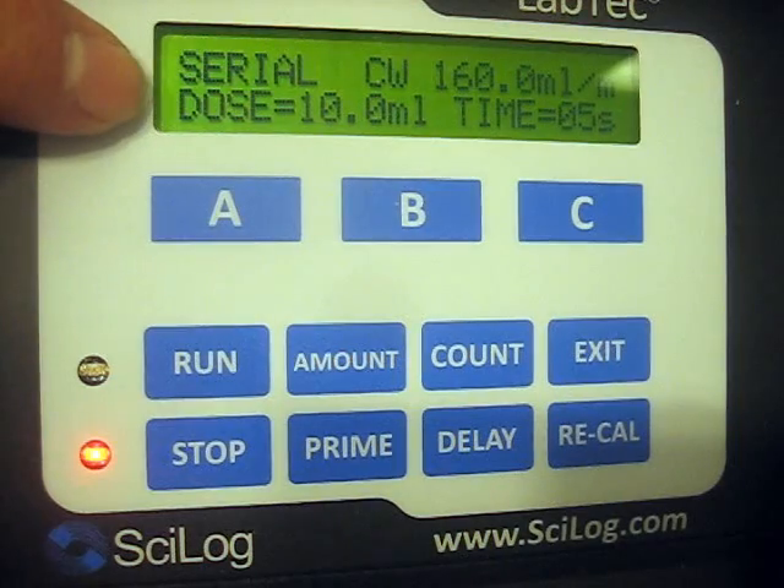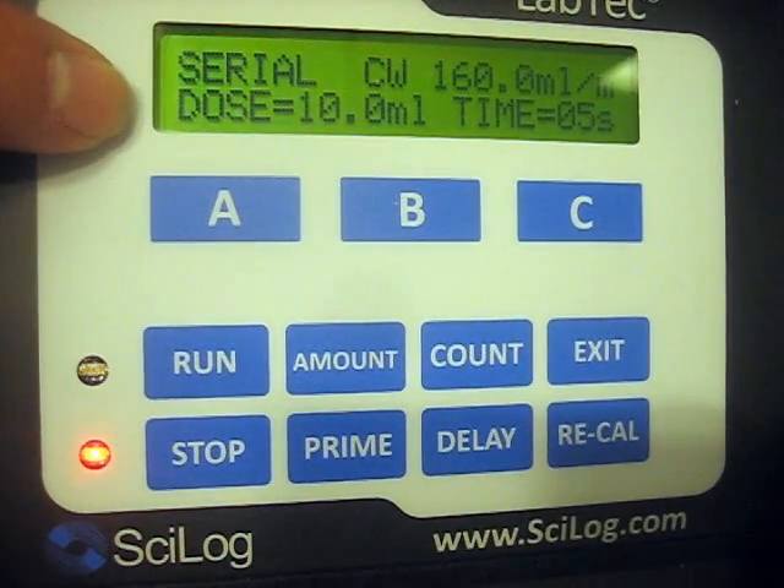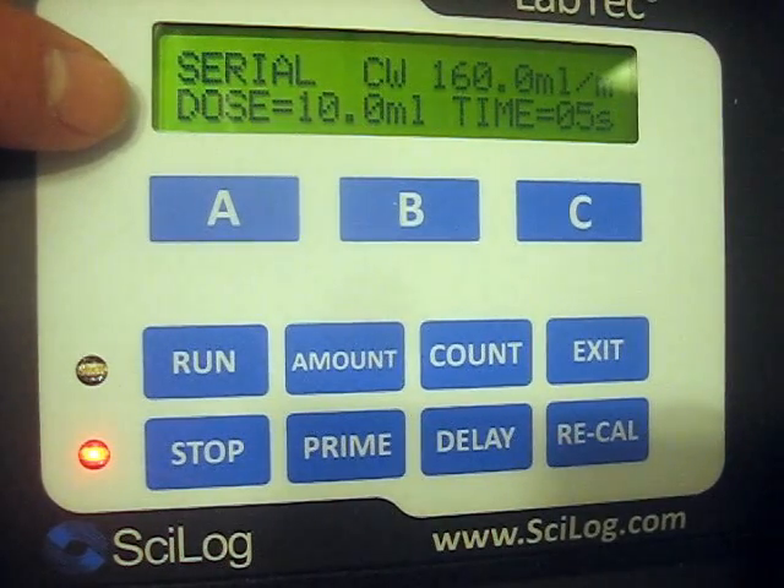The Labtech has shown you what your last dispense was: 10 milliliters, which is 100 milligrams. I now will change that and type in another dispensing amount, and you can see how that will change on your screen.